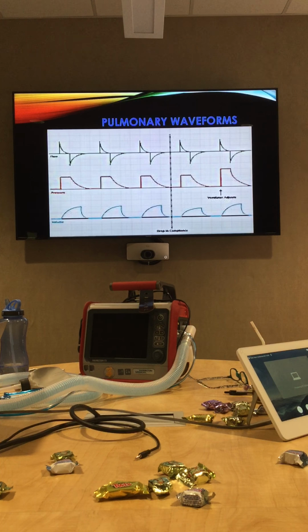This was actually made to be in a darker environment. One of the things there was an Oxford study back in 1977 by Hack and Mead, and what they evaluated was the typical types of ventilation that we are doing on a normal basis. So, pressure control, volume control.